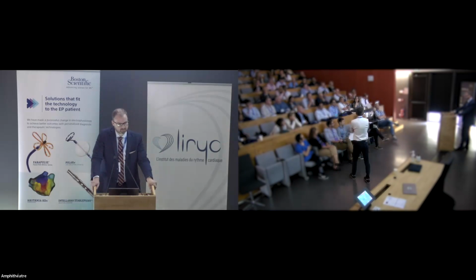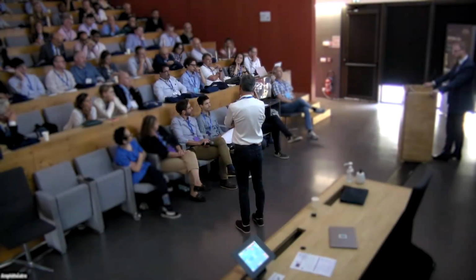At the maximum interspline distance, that's going to dictate the lowest field gradient. As he showed, the field gradient falls off with distance. So as they get a little bit closer, the field gradients are going to go higher, still producing an effective lesion, except in the area where there's a little bit of asymmetry. It's not that there's a huge void, and that's why we do a rotational application as well, so that you fill in areas that were previously low gradient with areas of high gradient. That's the purpose of the rotational applications.